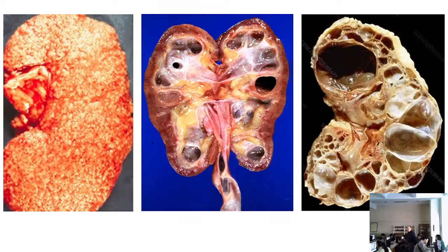And do you remember which these diseases are that, if not treated properly, cause this form of nephrosclerosis, meaning deposition of hyaline in the wall of arterioles and a thickening of the wall of arterioles? Which are these two conditions? Hypertension and diabetes mellitus. So, if not properly treated, they may destroy the kidney in such a way as the left image shows.